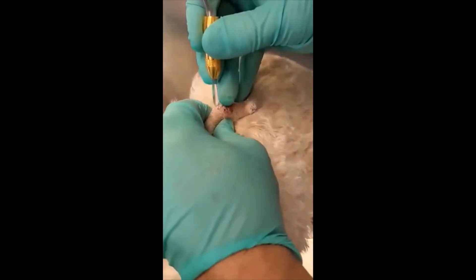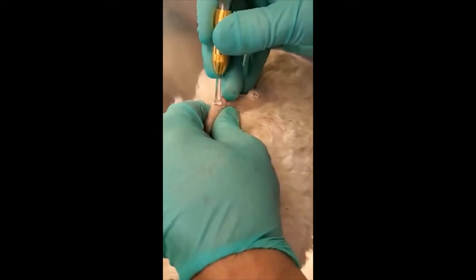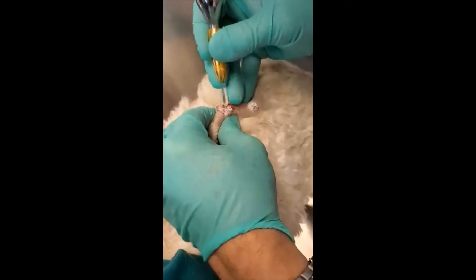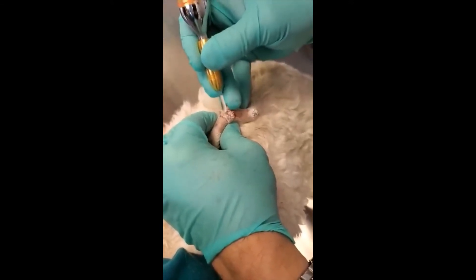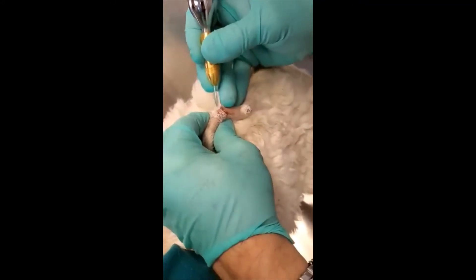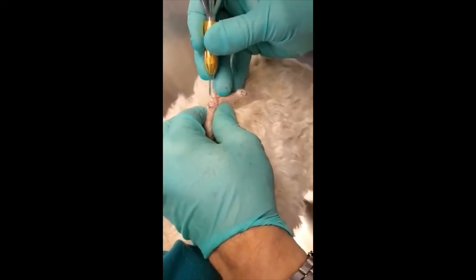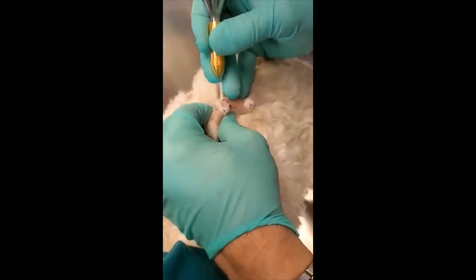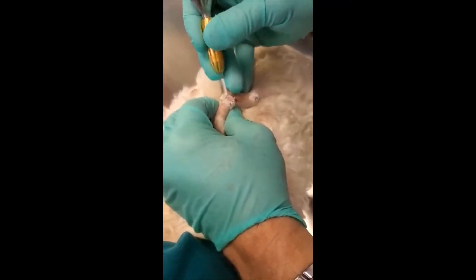So we have put a little lidocaine subcutaneously on all these masses. This dog is a little bit fractious, as well as the number of lesions present instigated the desire to block these lesions.